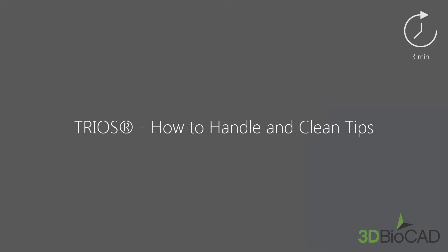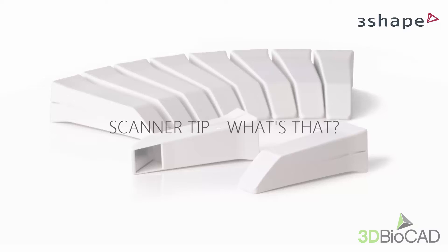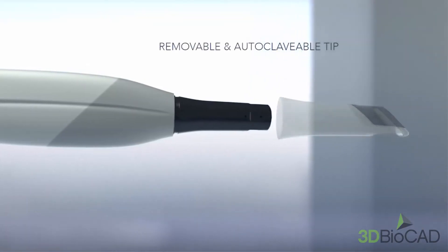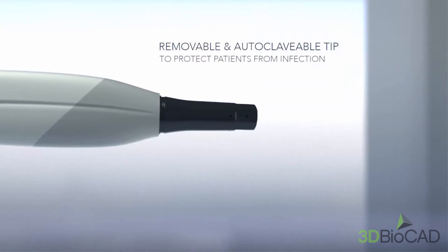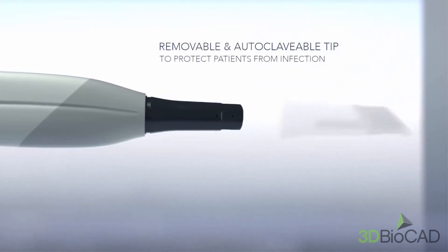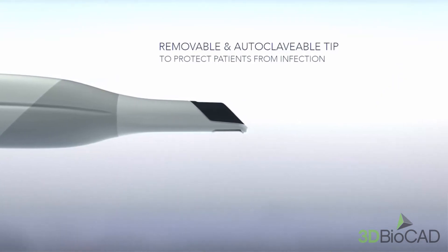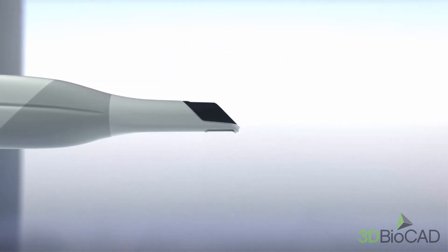In this video you will learn how to handle and clean tips. Why do we use the tip on the scanner? The tip is the part of the scanner which is inserted into the patient's mouth during scanning. The tip can be reused a limited number of times, but it must be cleaned and sterilized between patients to avoid cross-contamination.